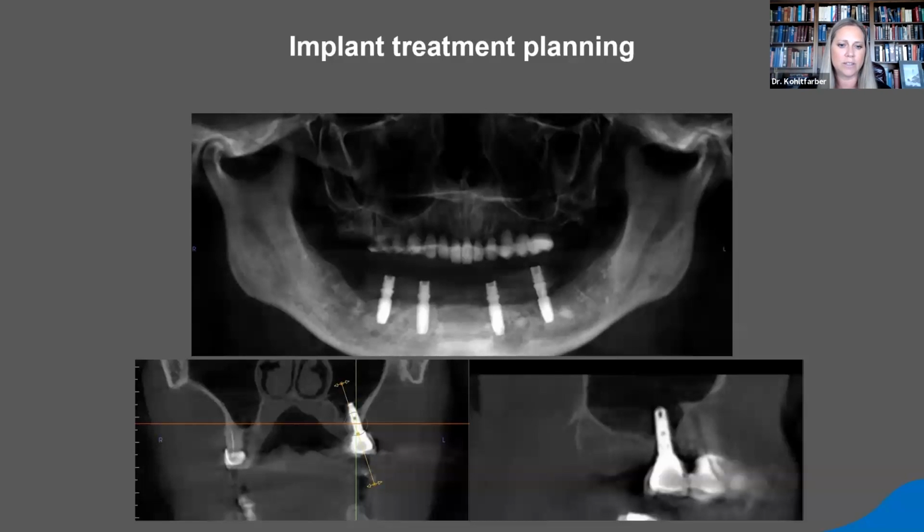Here's a couple of different examples of cases that maybe didn't have a surgical guide. Here we have an all-on-4, except for, oops, that one didn't quite seat. This guy, definitely we didn't have proper planning ahead of time because we can see that implant's hanging out in the sinus. And just because it's kind of hanging out in the sinus isn't necessarily bad.